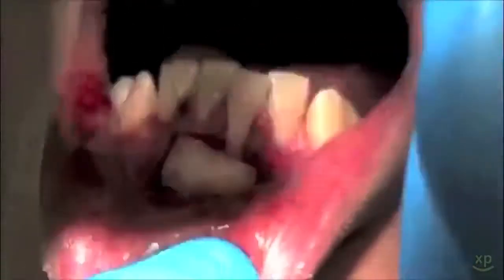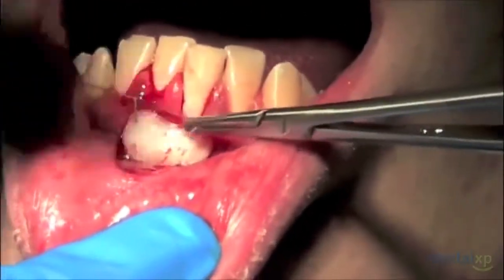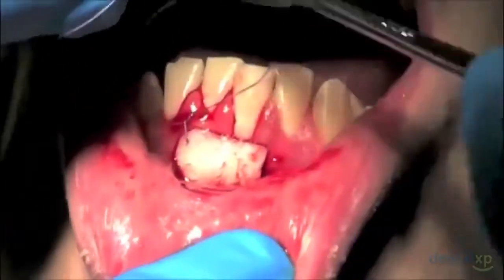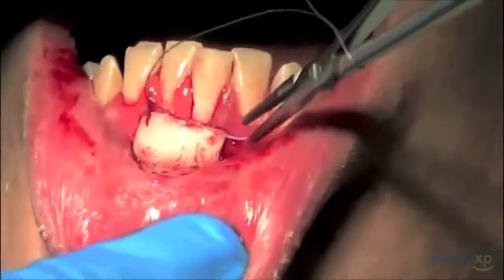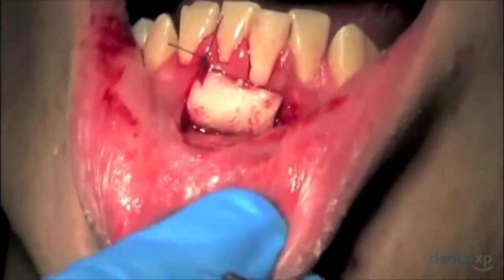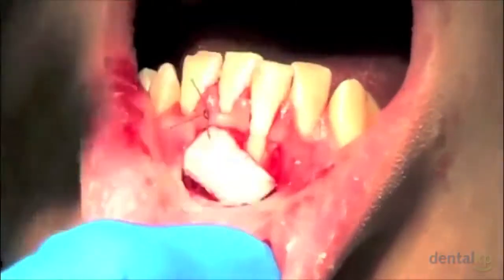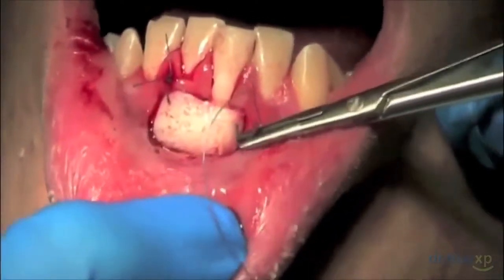As I'm suturing here, I want to point out that there are several suturing techniques that are available for use. I prefer just 3 interrupted sutures. Others may prefer to use some type of an anchoring suture or some type of a periosteal sling type suture as well. All of those are acceptable. I think the key thing here is to make sure that we have close adaptation of the graft to the recipient bed, as well as immobilization. Once the graft is properly immobilized, I will actually pull on the lower lip, frontwards, backwards, side to side, to make sure that the graft is truly immobile.